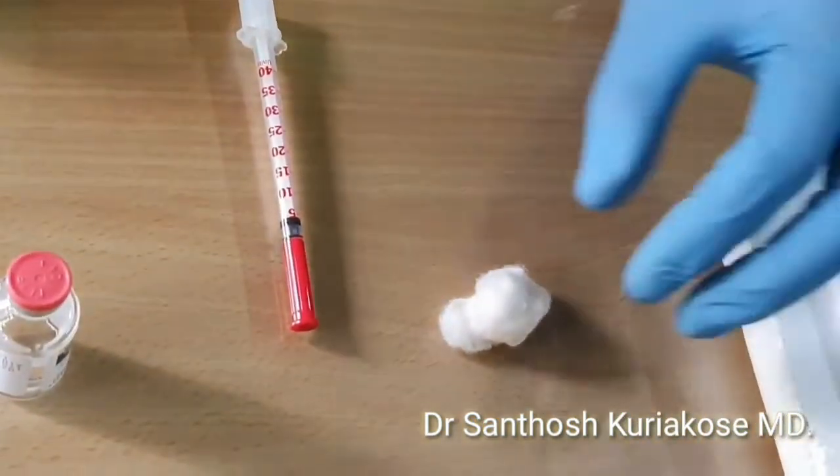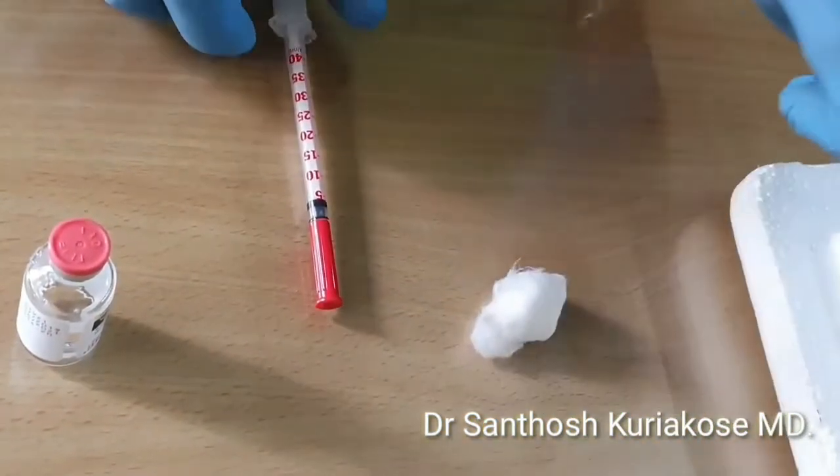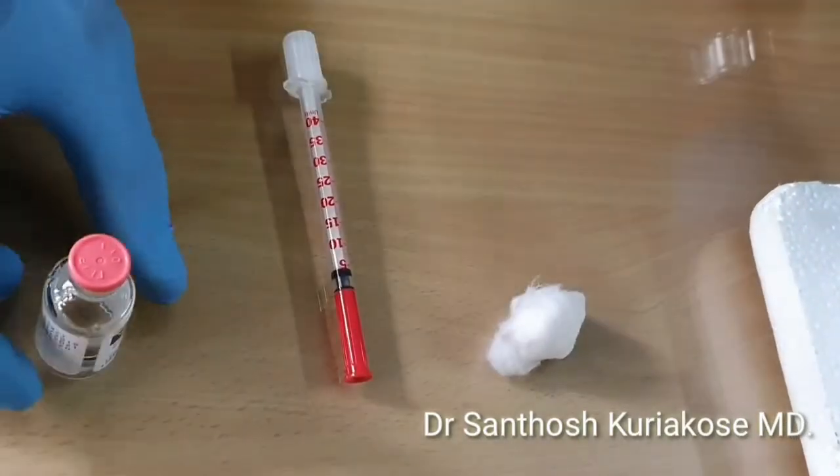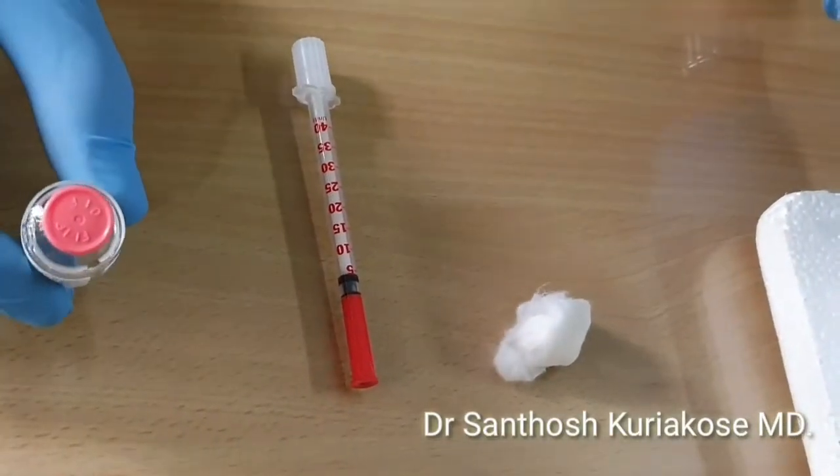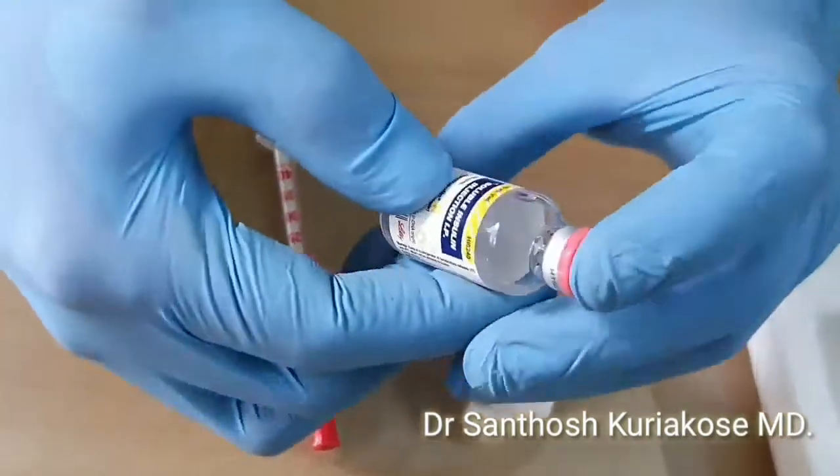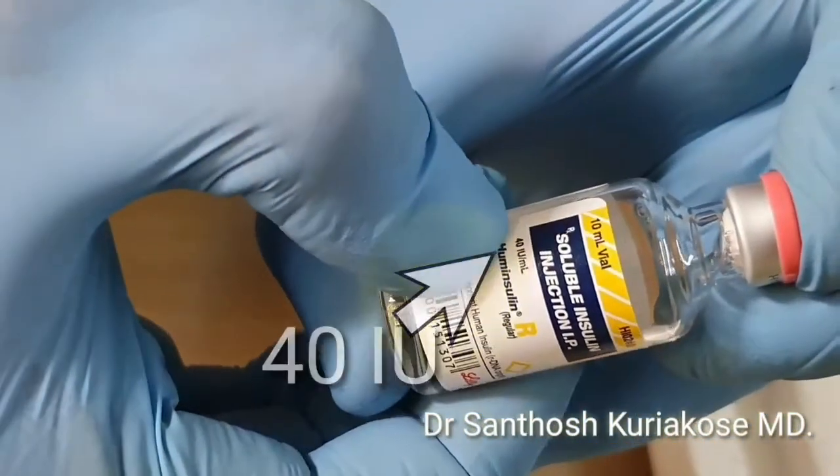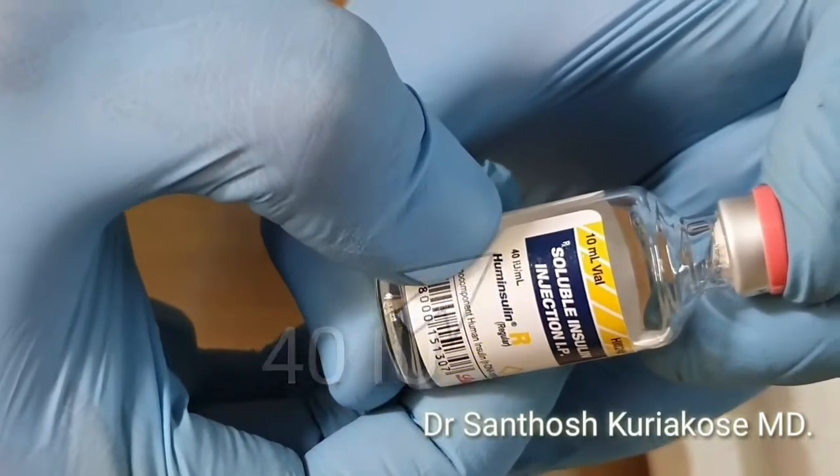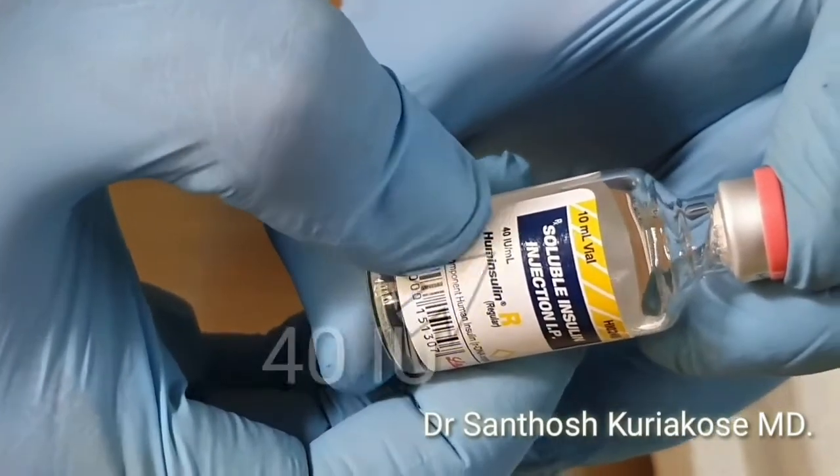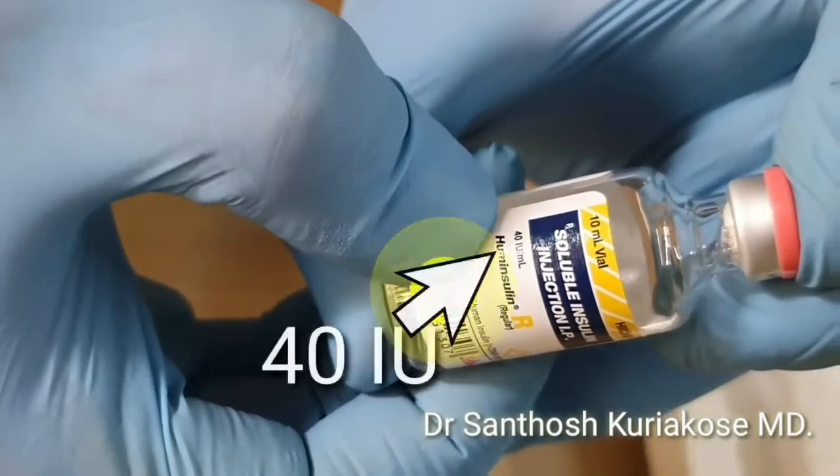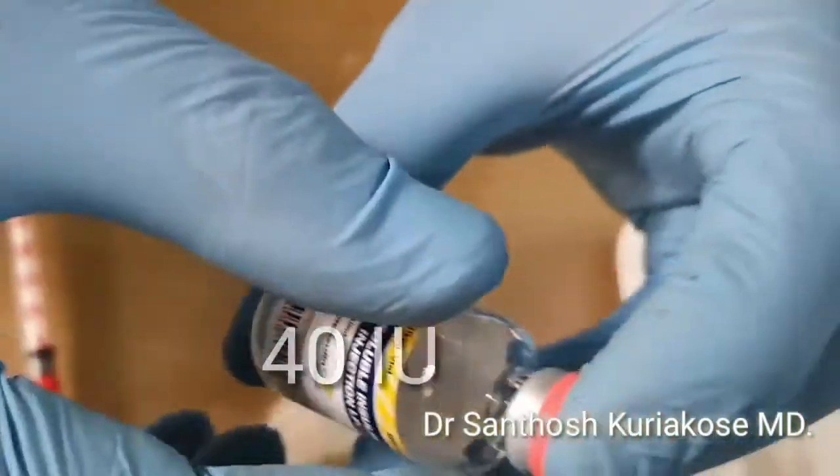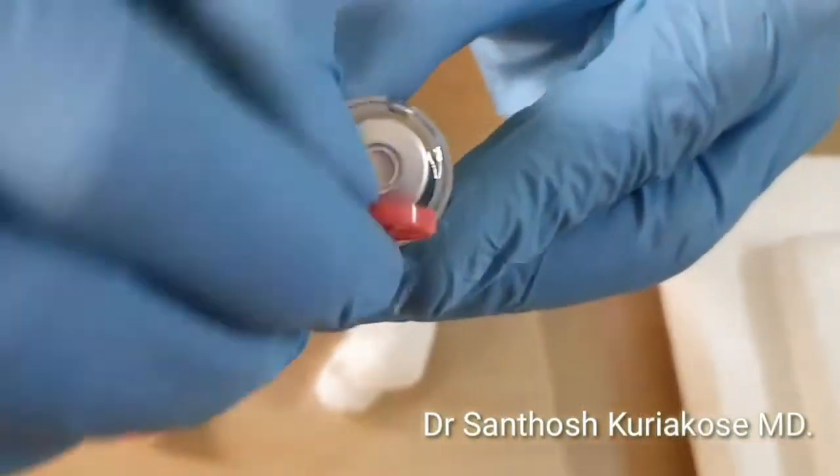To inject insulin, we need to have a spirit swab, the syringe to inject, and the insulin vial. If you see the insulin vial, it will be written either 40 or 100 IU. Here we are using the 40 IU, which will be prescribed by your doctor.